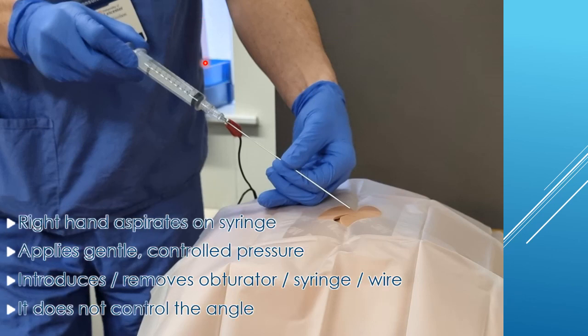Your right hand is less important. It controls the syringe and puts the obturator in and out, or the wire in and out. Remember, you need to be using the obturator with the long pericardiocentesis needle. It does apply some pressure, but it's gentle, controlled pressure, and the control is through your left hand. It clearly doesn't control the angle. Remember to control the angle by adjusting the needle closer to the skin. These factors are much more critical with the long pericardiocentesis needle than they are with a standard needle, but the principles of control and how you control the needle tip are still relevant.